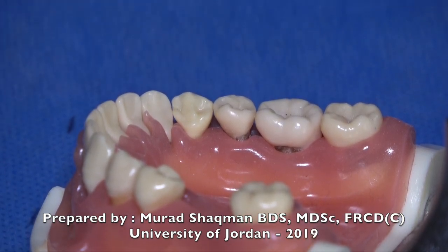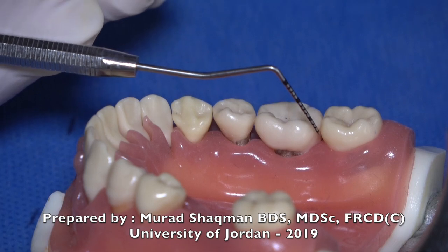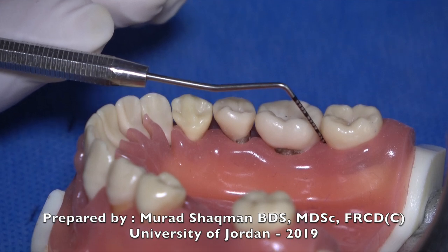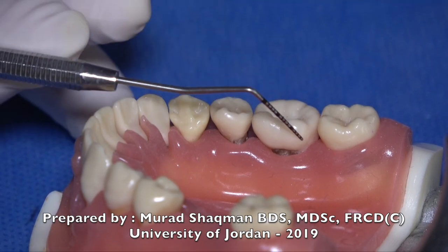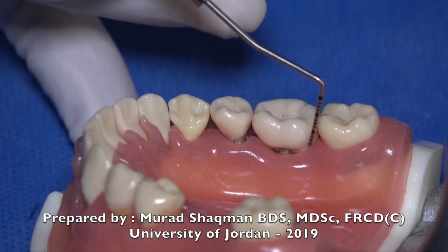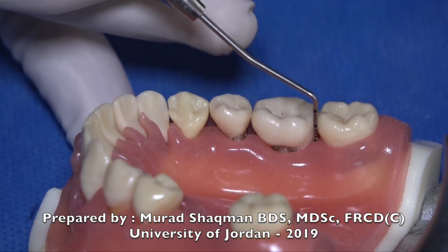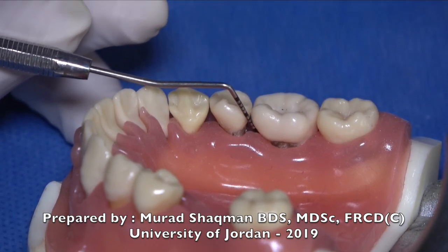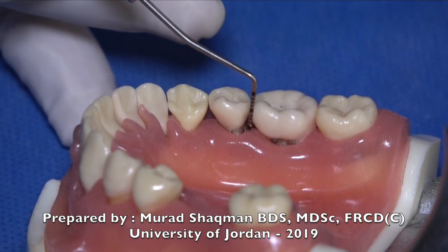When probing on the lingual of the posterior mandibular area, probing the mesial of the lower seven, you go in at the proper angle. When switching to the distal, you cannot maintain the same angulation — you would be poking into the gingiva. Tilt so your first two millimeters are flat on the distal surface of the first molar and then slide and probe. Then going to the distal of the second premolar, go out, tilt, and probe again.